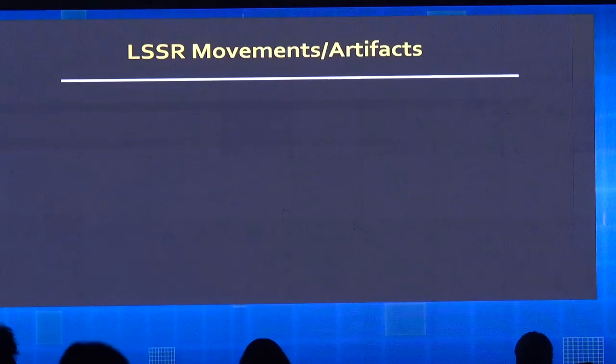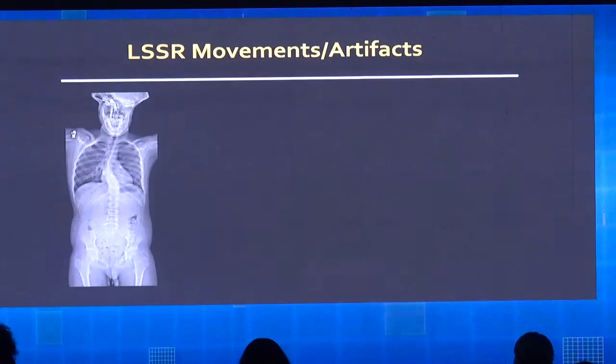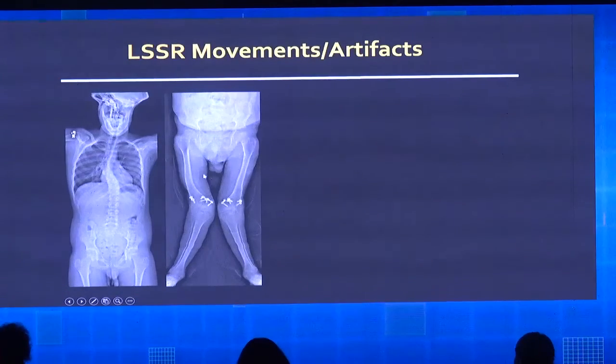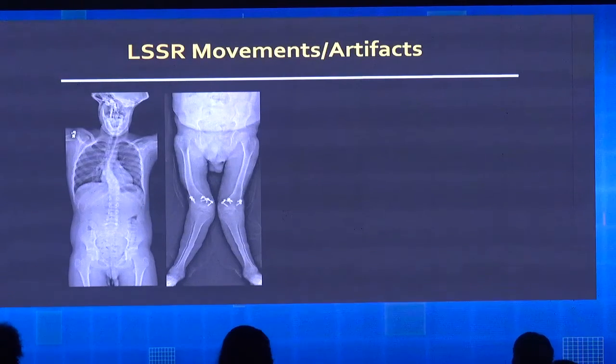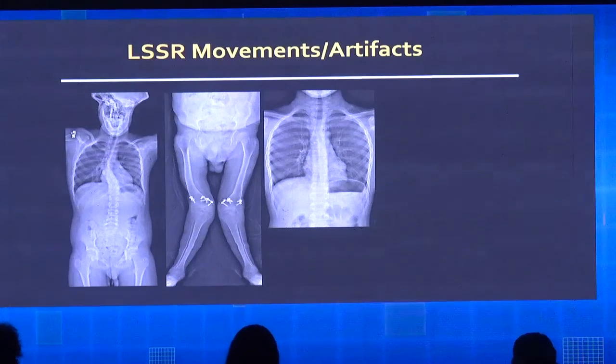appearance of skeletal dysplasia. Some examples. So there is no pneumothorax, there is no pneumomediastinum, it's just a beam hardening artifact, usual with that. This patient has bilateral knock knee, but this kind of undulation here is related to a little bit of a shiver at the moment of the imaging, because the scanning is roughly 8 seconds. So you need to have a patient who is standing still.